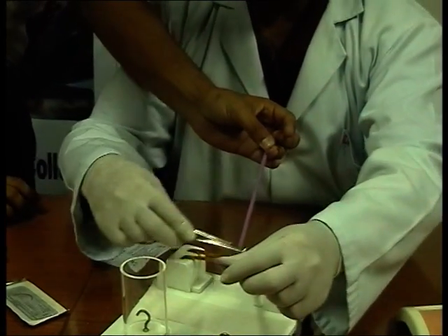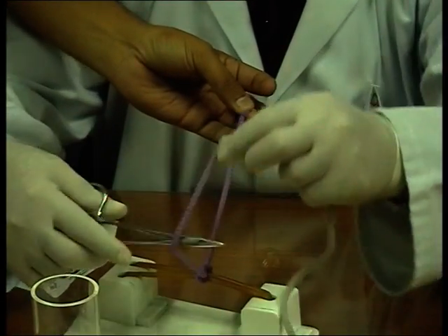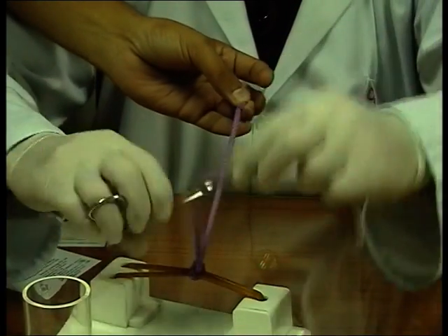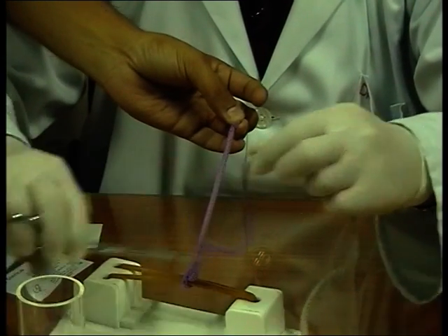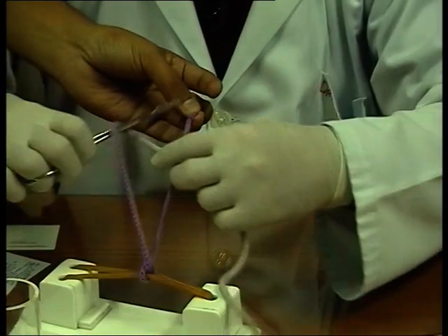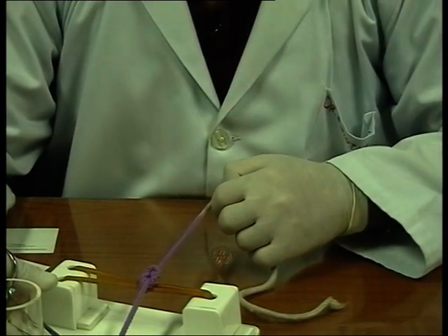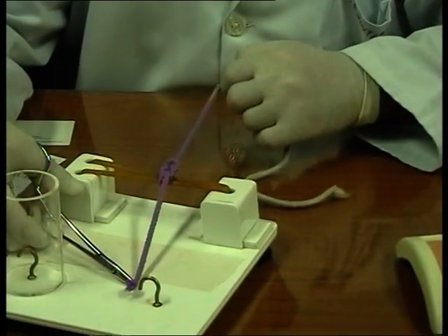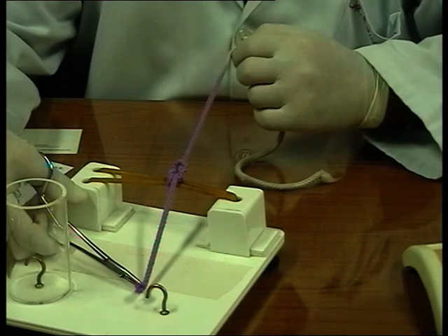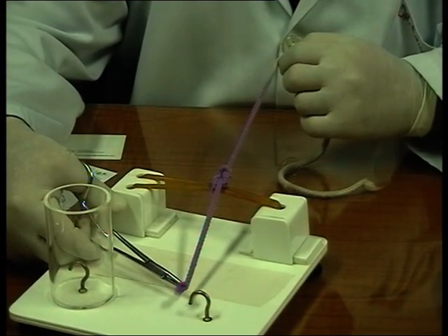Now, we again have a V. Now I'll stay within the V. Very common mistake. Just because you went anti-clockwise is not okay. Staying within this is important. And I'll cross back. Again, if you see, we got a reef knot. But that's a reef knot, which you must get all the time.